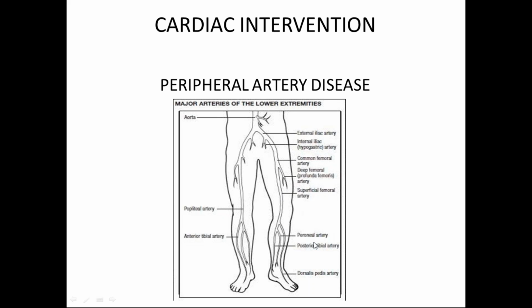Okay, if you have a cuff in the calf or the leg, and the waveform in the lower thigh is normal, and this is abnormal, then it suggests that the obstruction is between here. And similarly, at the ankle, if everything above the ankle is normal and this is abnormal, then it suggests that the obstruction is right there.